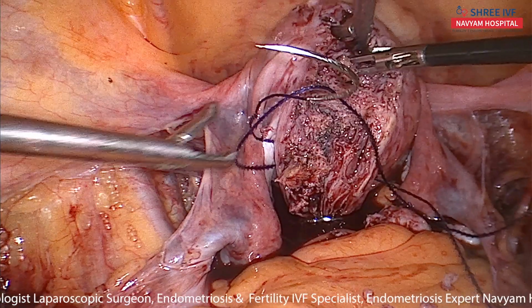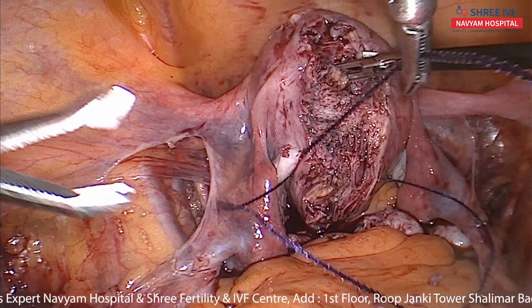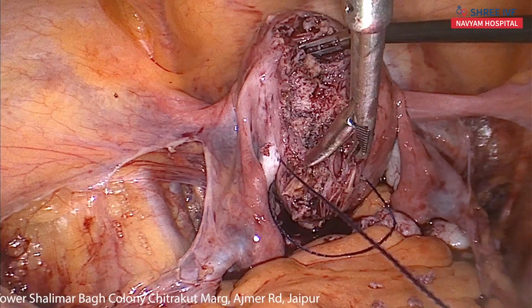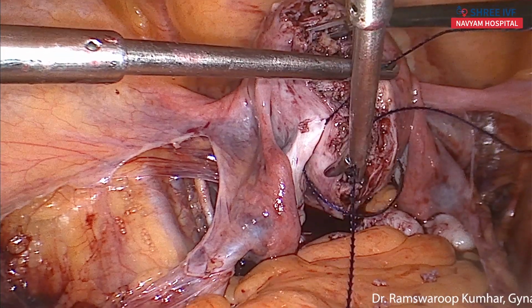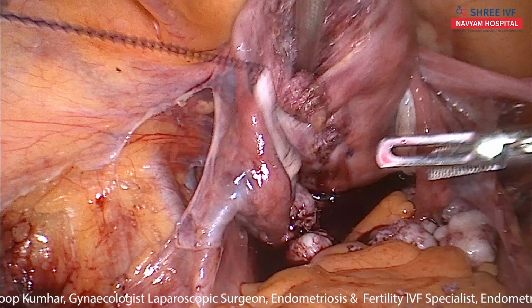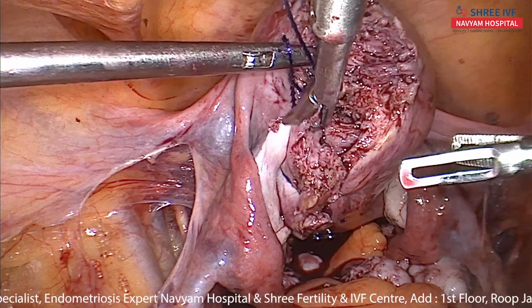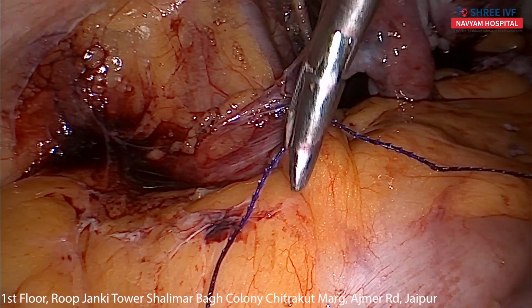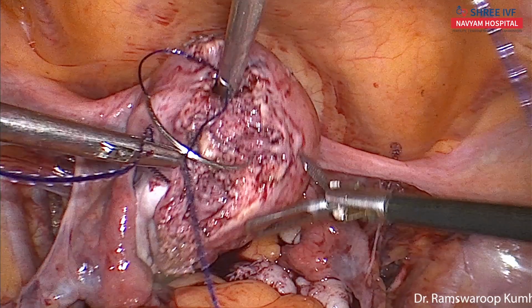Hold like this. Hold the uterus like this from above.